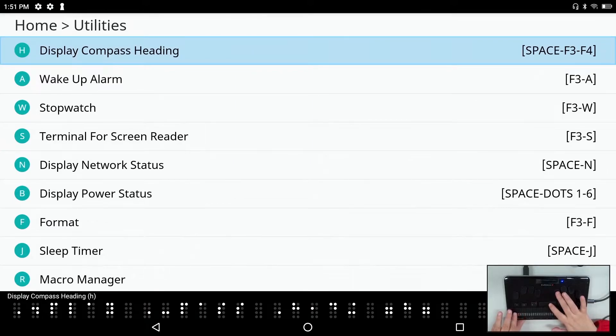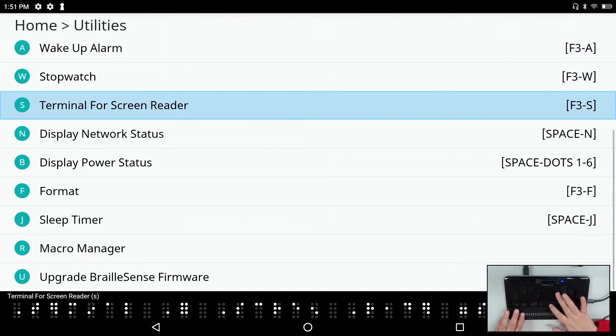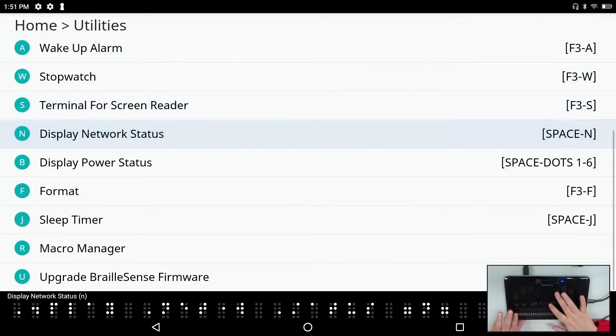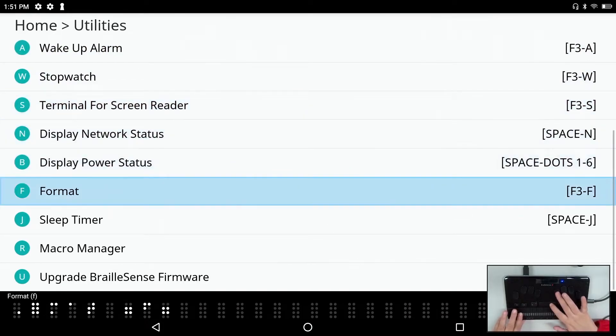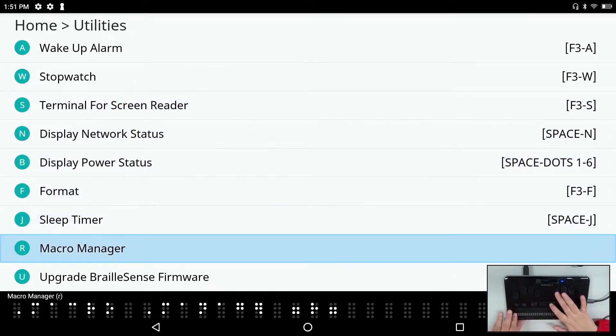Also in utilities: display compass heading, wake up alarm, stopwatch, terminal for screen reader, display network status, display power status, format, sleep timer, macro manager, and upgrade BrailleSense firmware.